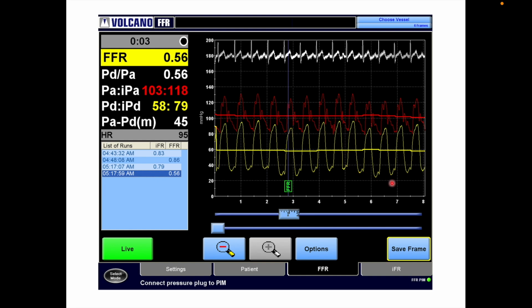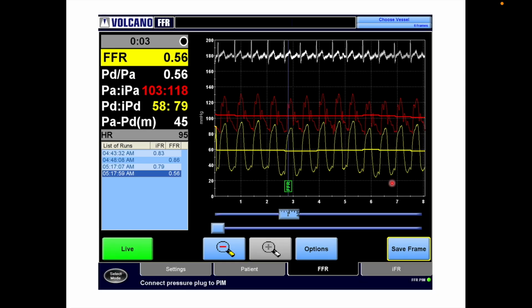So this is accurate, and this patient has significant triple vessel coronary artery disease, and therefore we changed the whole plan, and now instead of circumflex and RCA stenting, this patient went for CABG, because this is where the prognostic disease is. You can't leave distal left main and ostial LAD significant disease and just fix the circumflex and come out. So that's the difference that the FFR brings in, and that's how you differentiate between diffuse disease and where you have a serial stenosis. You can see where you have a focal spot which can be stented, or within the diffuse disease if you have a focal spot which can be stented.